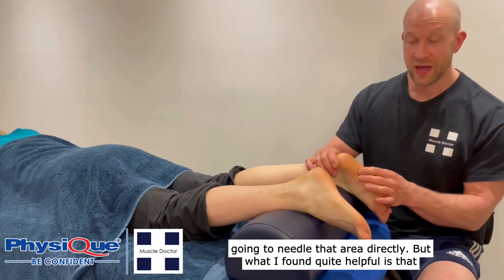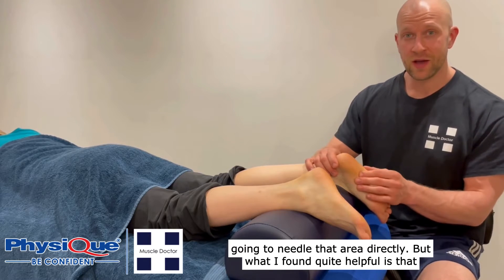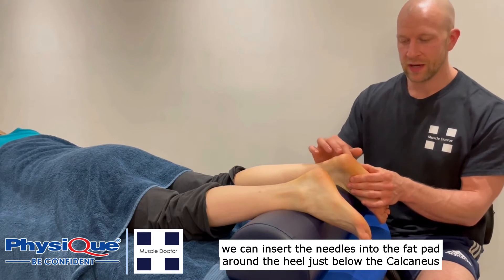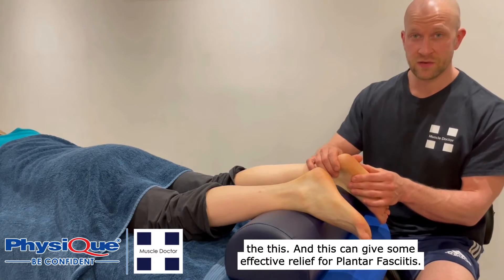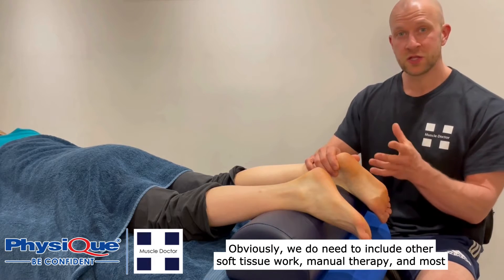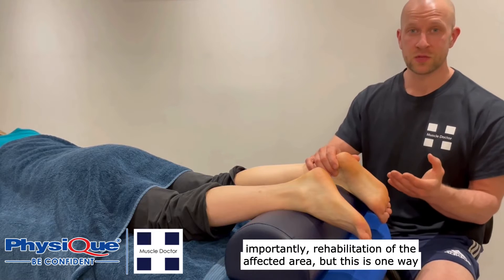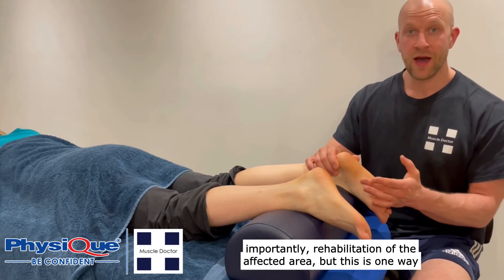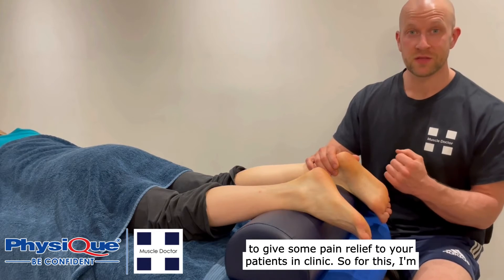We're not actually going to needle that area directly, but what I've found quite helpful is that we can insert the needles into the fat pad around the heel, just below the calcaneus, and this can give some effective relief for plantar fasciitis. Obviously we do need to include other soft tissue work, manual therapy, and most importantly rehabilitation of the affected area, but this is one way to give some pain relief to your patients in clinic.